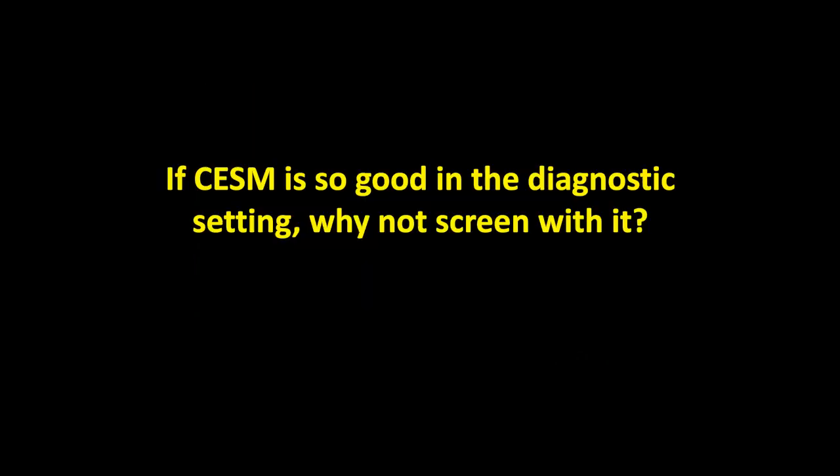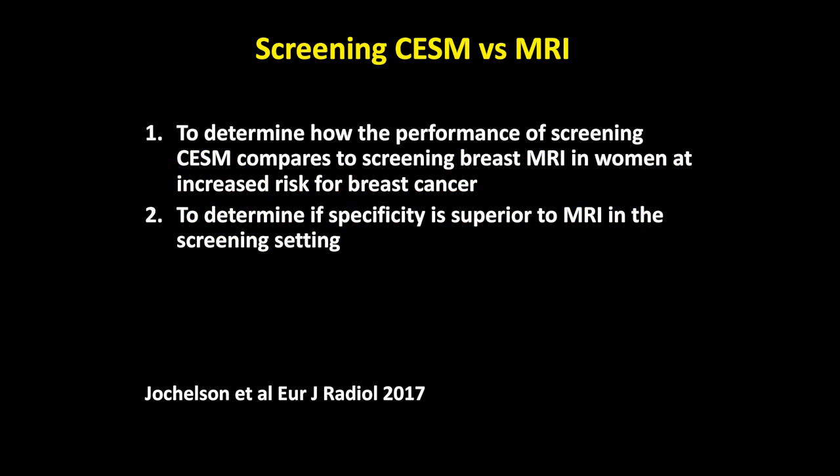So we looked at the fact that contrast mammography was so good in the diagnostic setting, we thought about using it for screening intermediate risk women. We completed a prospective trial comparing contrast mammo to breast MRI to determine how the performance of screening contrast compared to MRI in women at increased risk for developing breast cancer.